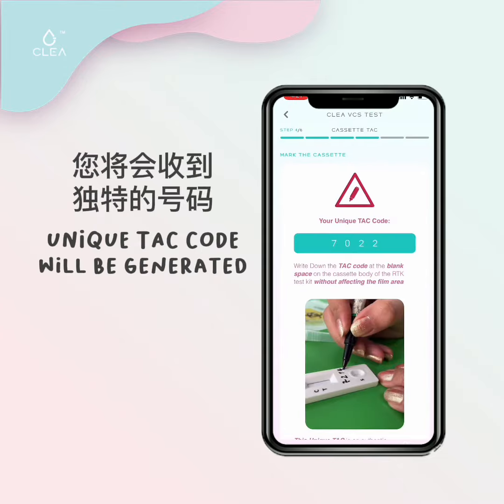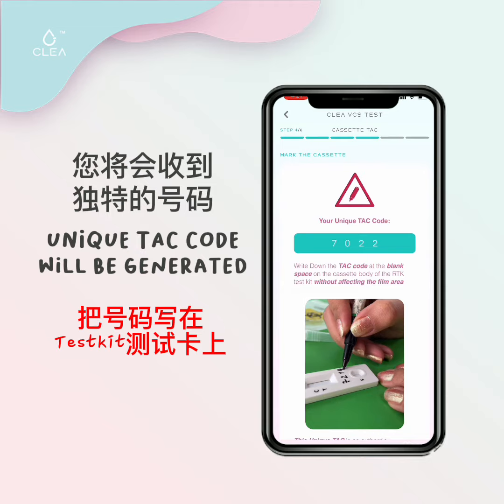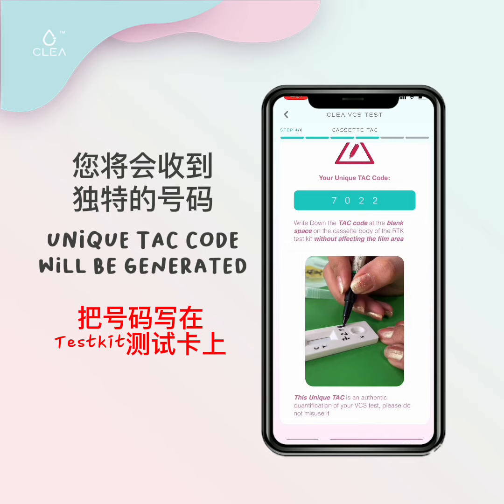The system will then generate a unique TAC code. Write the 4-digit code on the cassette of your test kit. Once you have written it down, click on continue.